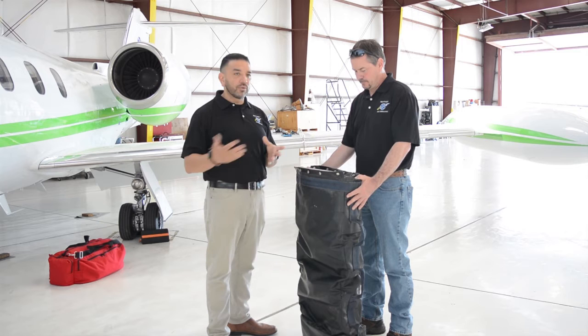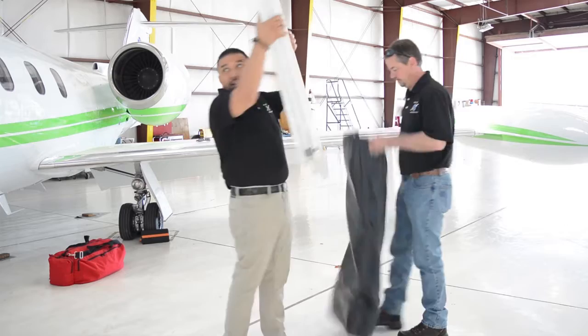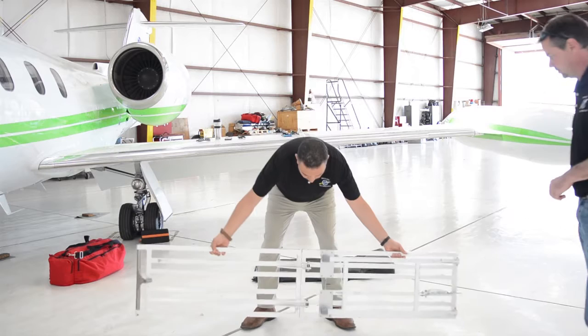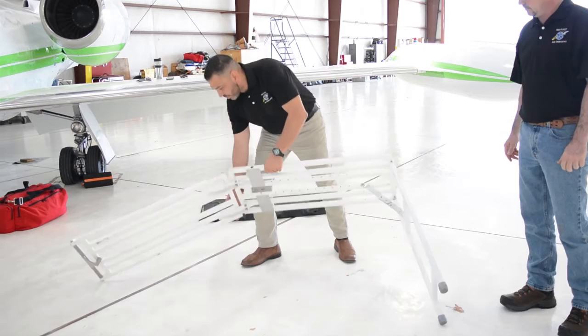So removing it from the bag, Greg is going to just be holding the bag down. I'm just going to bring it out. You want to always do this clear of the door there, because you don't want to lift this out of the bag underneath the door and hit the aircraft. So once I have it out, you can see that it actually opens up. We're going to make sure that we open it all the way up. This leg extender is going to be all the way out. You want to make sure that that's all the way open, and then you're going to get it ready to post in the aircraft.